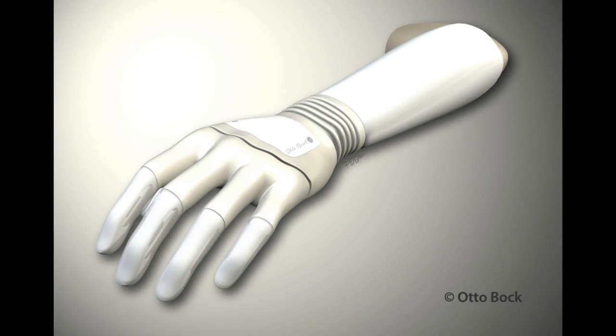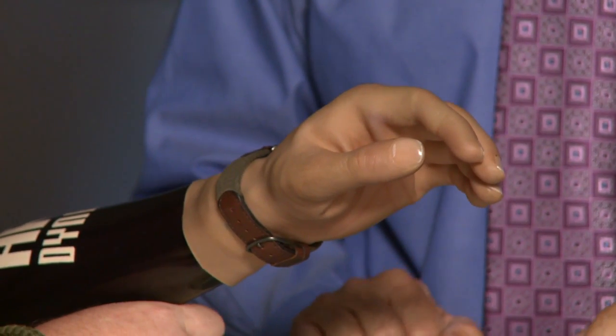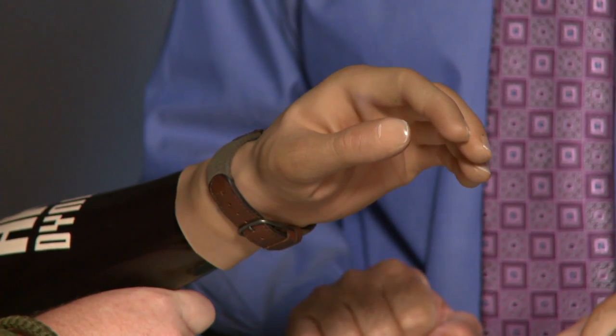At Advanced Arm Dynamics we have the opportunity to work with a lot of new technologies, but we're really excited by the Michelangelo hand. I'd like to introduce our patient Ethan. Ethan has had the opportunity to be working on the Michelangelo project for the last three and a half years. Ethan, can you tell us a little bit about what's different about this hand? The products that I've used in the past basically had one grasp pattern — the three-point pinch.